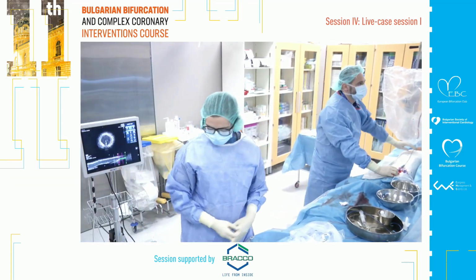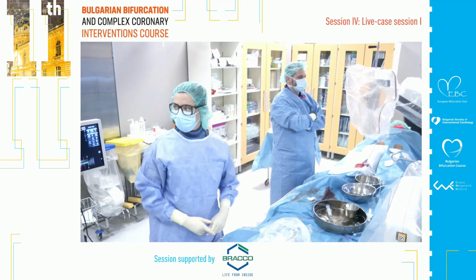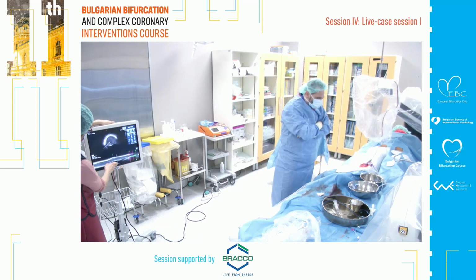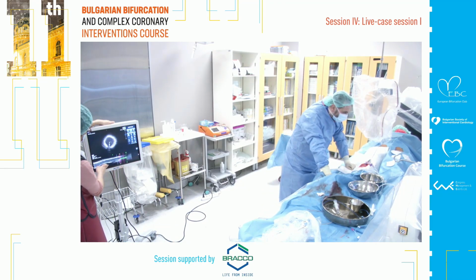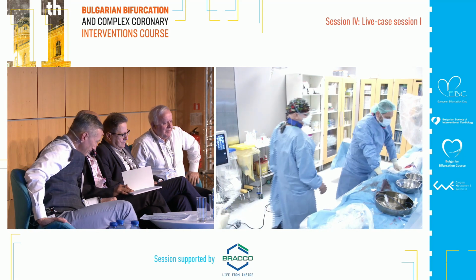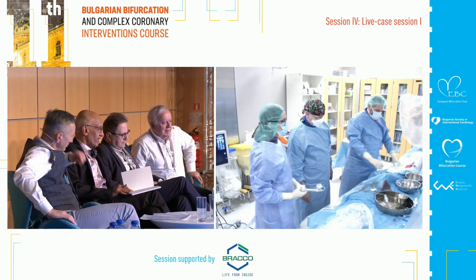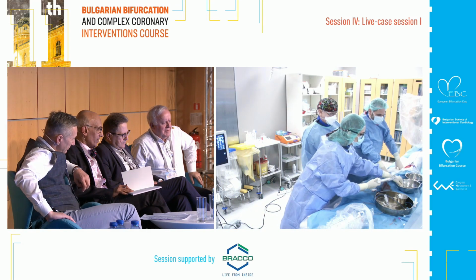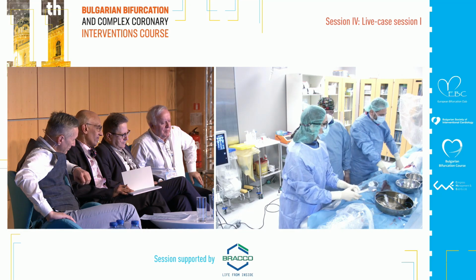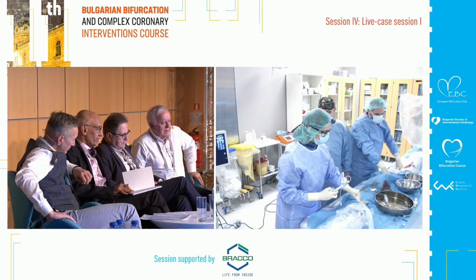But you are going to post-dilate, correct? If you're going to post-dilate, why don't you just use that balloon to pre-dilate? I don't understand, sorry, repeat. You are going to post-dilate with a non-compliant balloon, correct? Yeah, so probably you could use the same balloon to pre-dilate. But me and Valerie are of the opinion to not pre-dilate, just because the plaque is very soft. So we go for direct stenting, and then we post-dilate after.